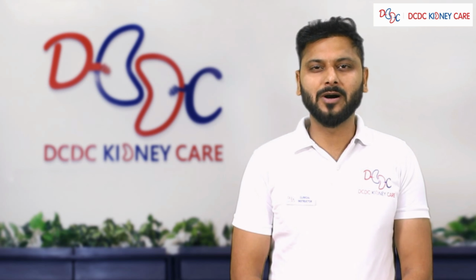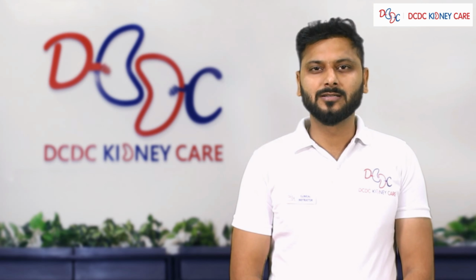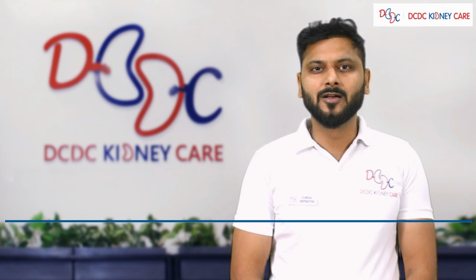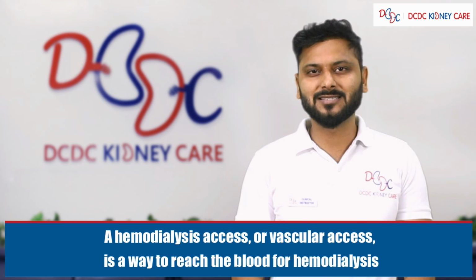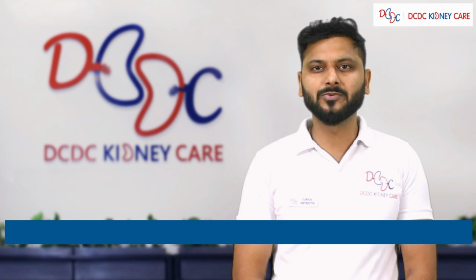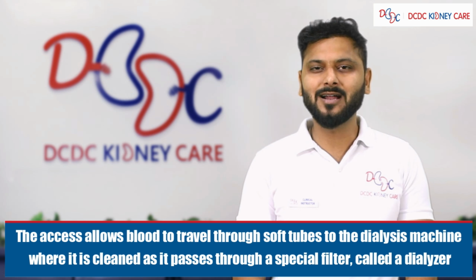Today we will talk about vascular access handling, and after this topic you will be aware about the correct ways of vascular access handling. Vascular access definition. A vascular access or hemodialysis access is a way to reach blood for hemodialysis. The access allows blood to travel through soft tubes to the dialysis machine, where it is cleaned as it passes through a special filter called a dialyzer.